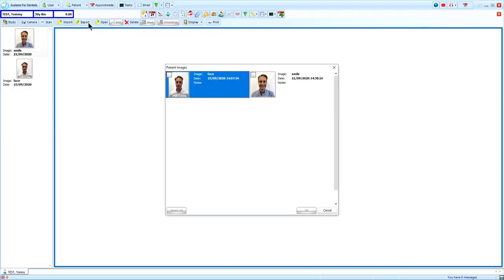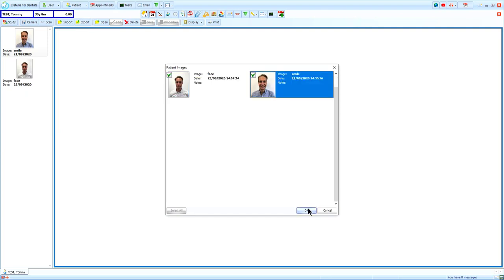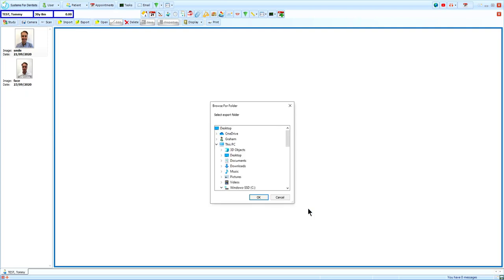Export lets you output a number of images in one go. Tick the images you want exported, then click OK to choose the location you want to save them.